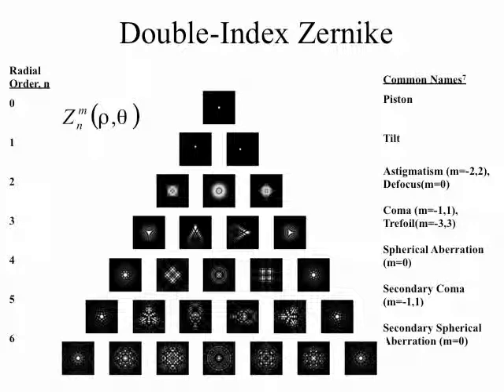And I show you this not so much to get a sense of what's going on quantitatively. These are things that are extremely quantitative, but they're not really quantitative in a clinical sense. Rather, this is data that we're gathering in terms of the shape of the patient's wavefront, because there may be some clinical circumstances in which we correct for the wavefront.